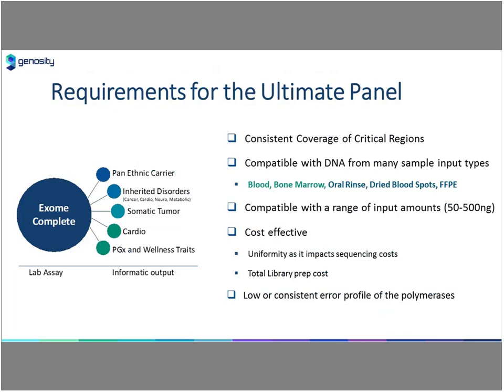And so these requirements are listed here on the right. There are others, but these are the primary ones. So first and foremost, do we get consistent coverage of our critical regions? So this is that reproducibility of capture, but then also the critical regions that we defined. Can we even capture them with the methodology?